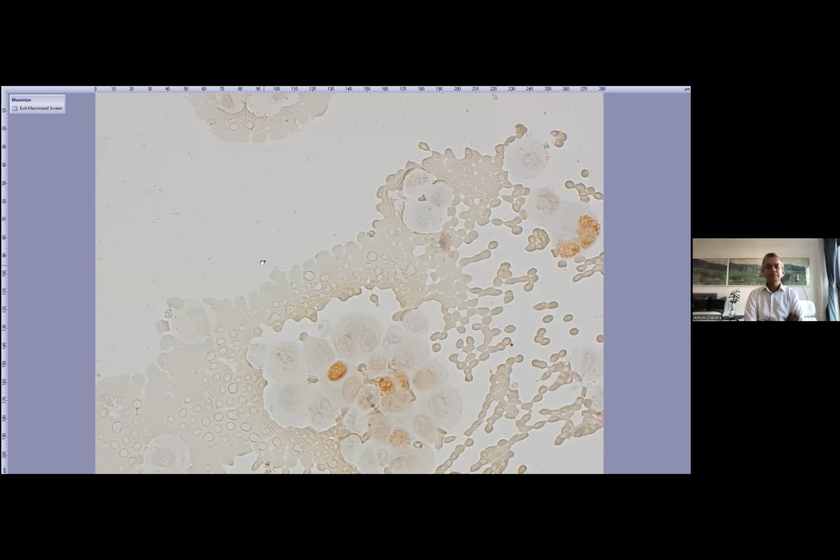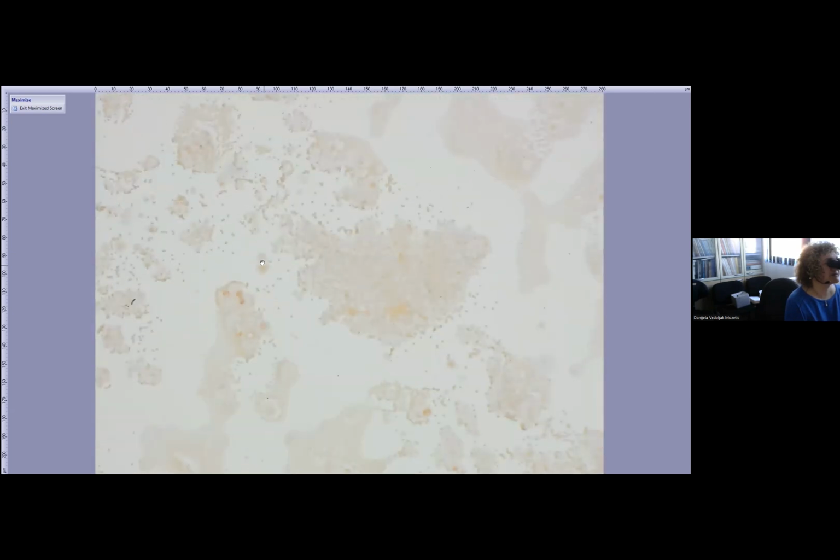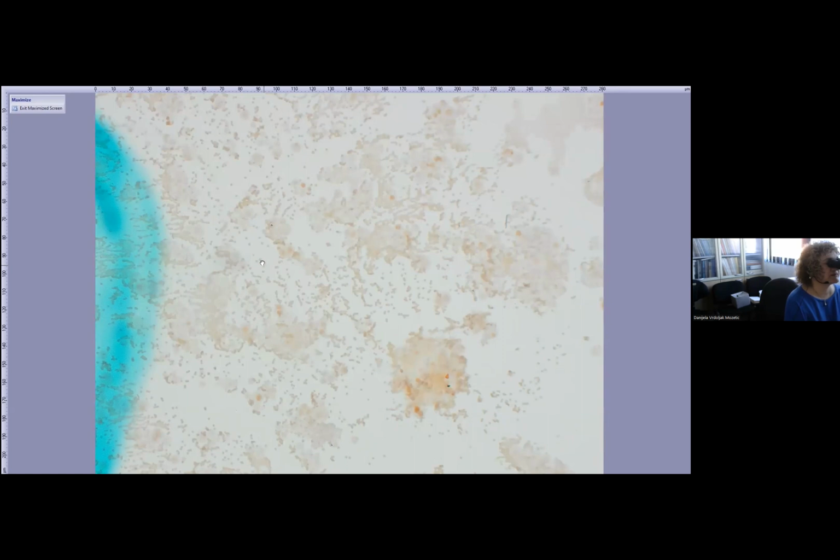So this was a really difficult case for us, but finally we pronounced it negative for malignancy because we didn't know what these strange cells were, with these elongated nuclei. So I see. And there was no clinical correlate to explain these on the histological sample.